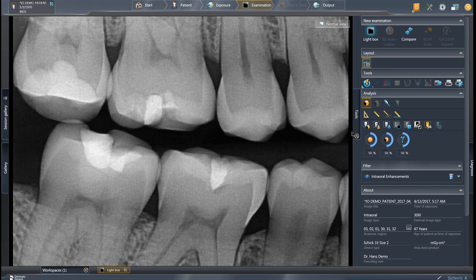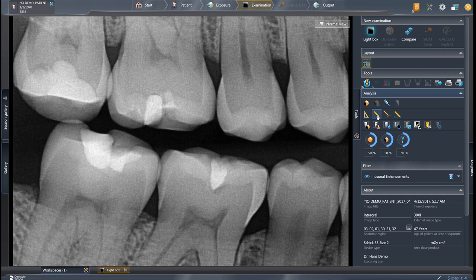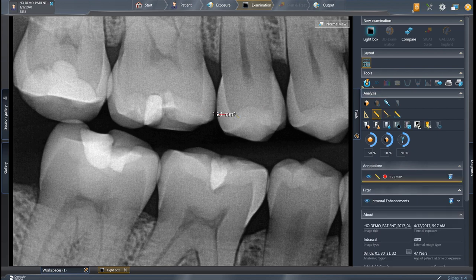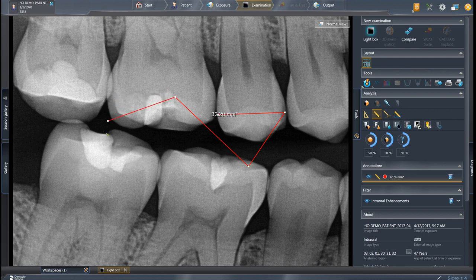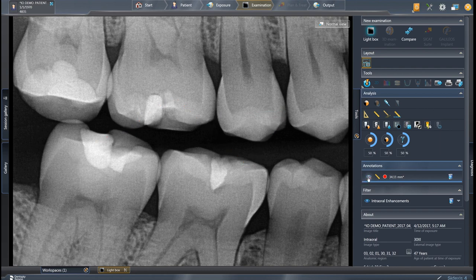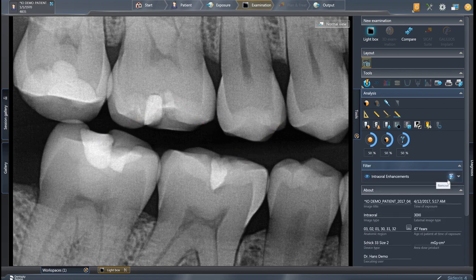You can also create length measurements and annotations. For a length measurement, click once to drop the first point, click again to drop a second point, and continue adding points as needed. Double-click to finish the measurement. You can click the eye icon to hide the measurement or show it again, and click the recycle bin to remove it.